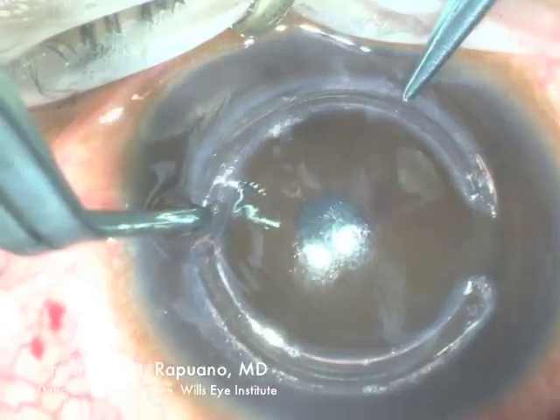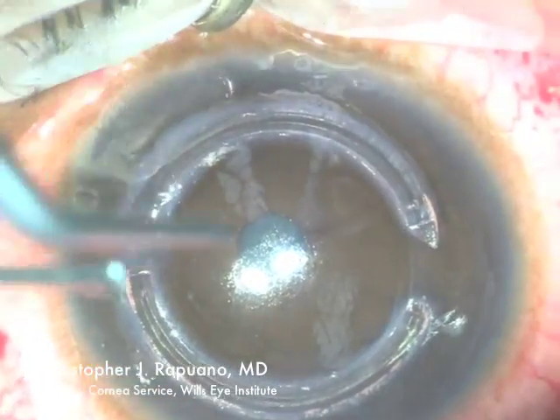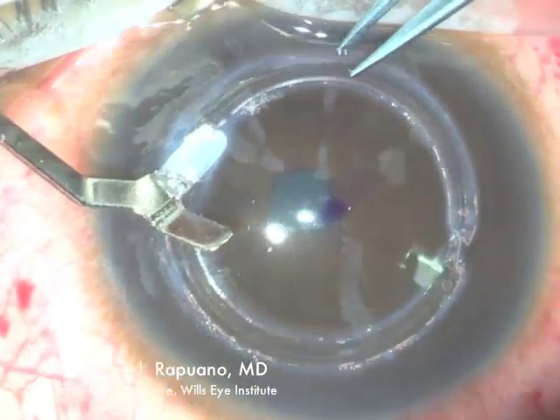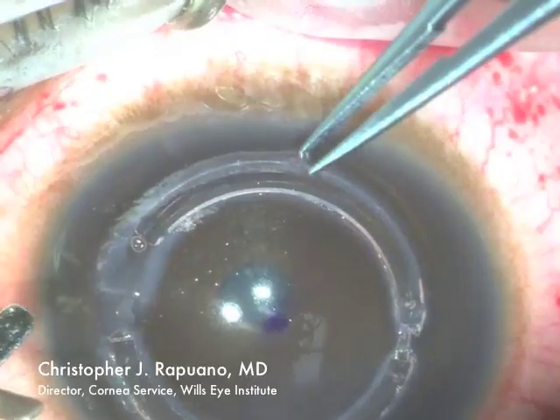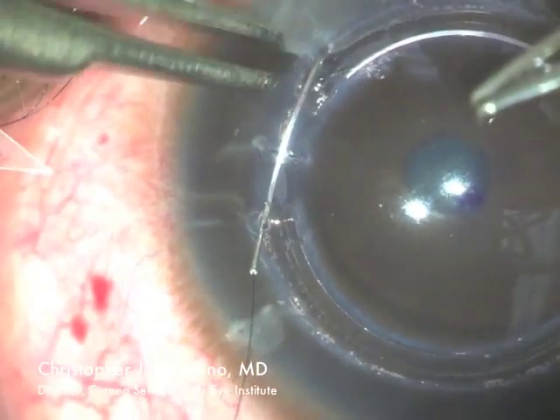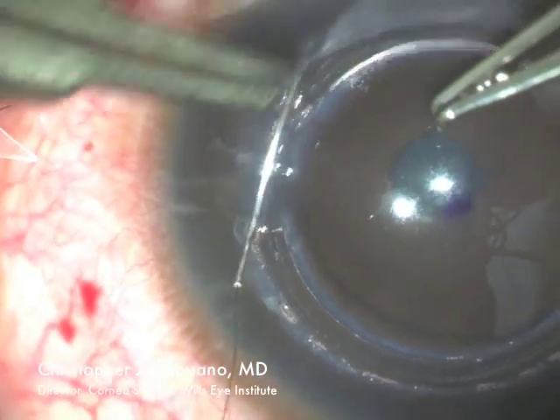There, the intacs is popping into the wound and then it'll be pushed in a little bit further so that it doesn't sit right next to the incision. Next, one suture is placed into the incision area to close that wound.